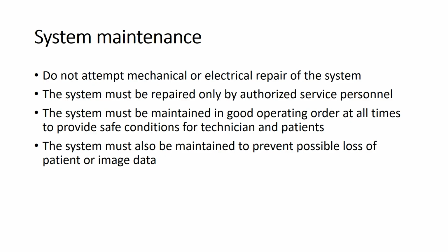Let us discuss the DR system maintenance. Do not attempt a mechanical or electrical repair of the system, and the system must be repaired only by authorized service personnel. So, you have to keep this in mind. Always call authorized service personnel.